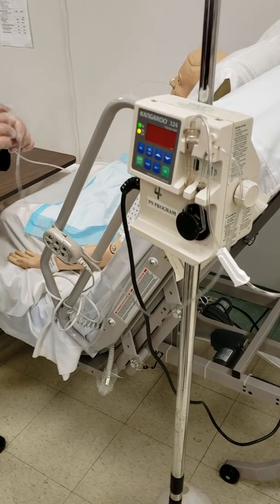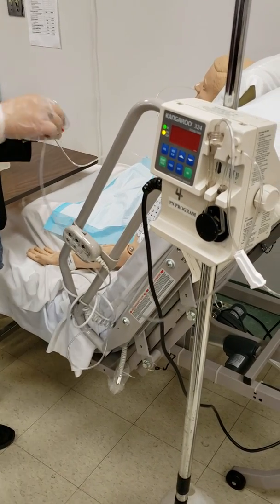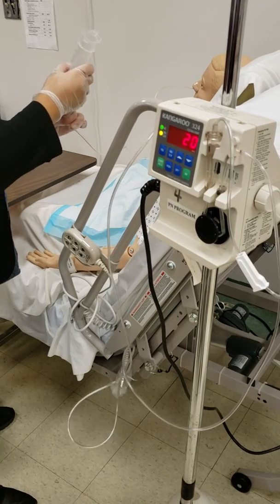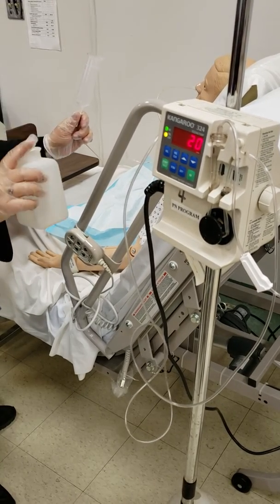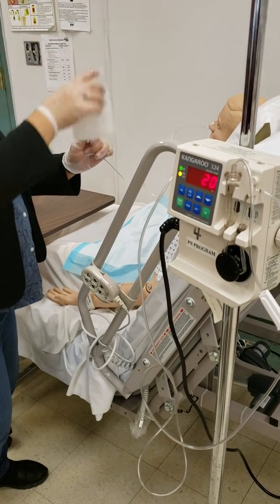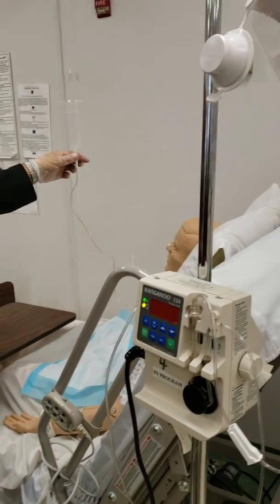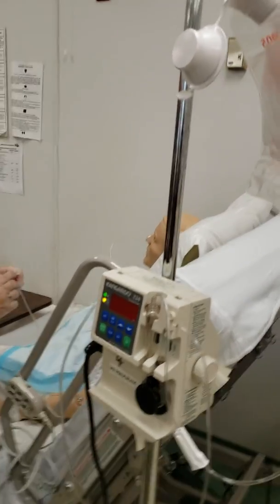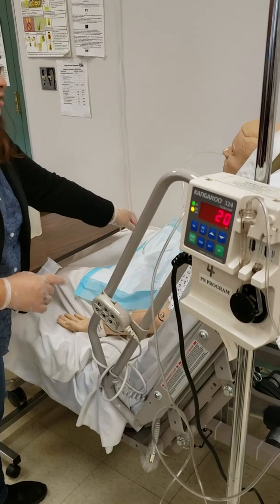You will grab this, all right, and then you have to flush. After you feed the patient, you have to flush. So 30 ml of water, flush the tubing by gravity, and then you will just cover the tubing, and you're done.